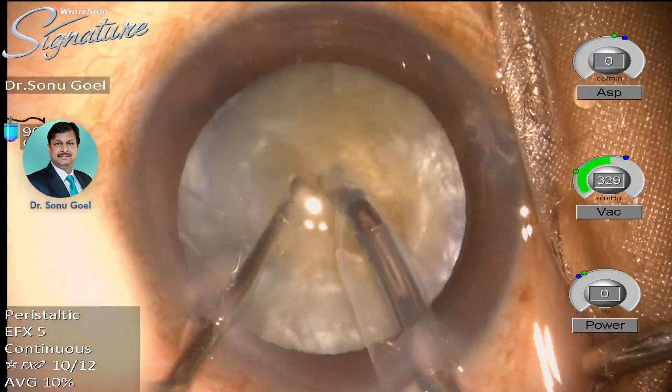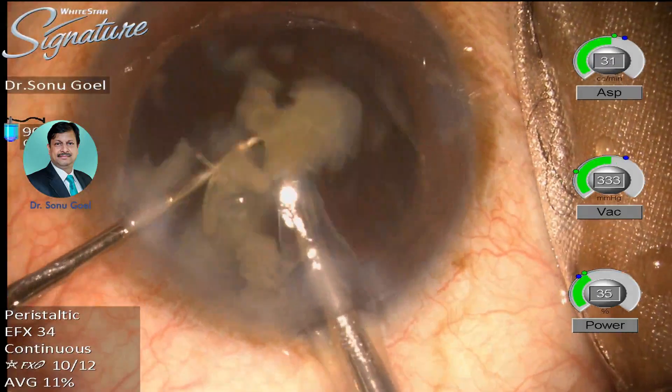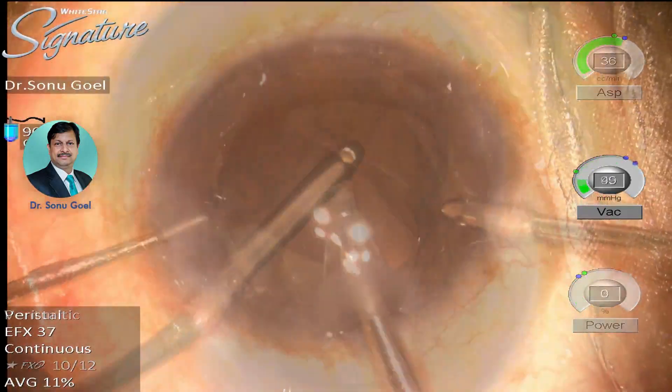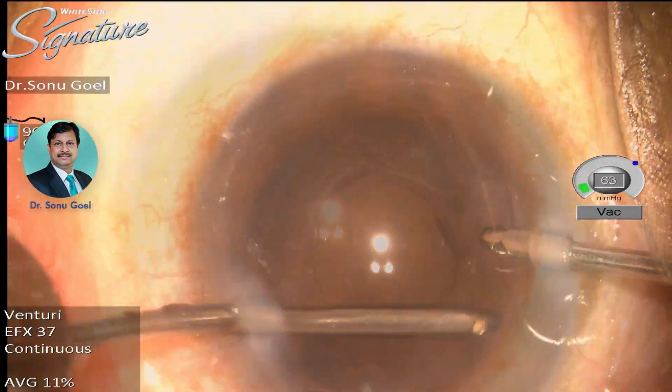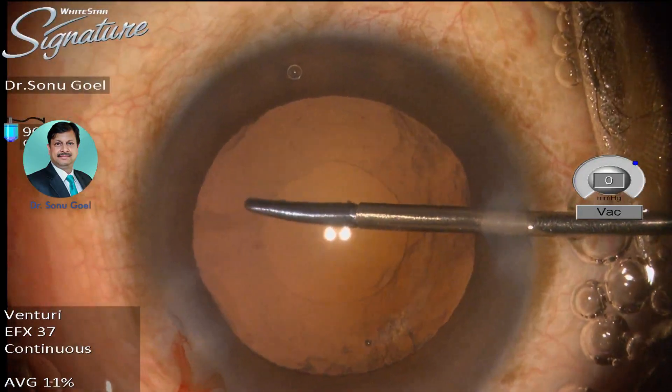The basic principle is to decompress the bag, then flatten the convexity of the lens-bag complex, and then, once it is flattened, gradually fashion a good rhexis.